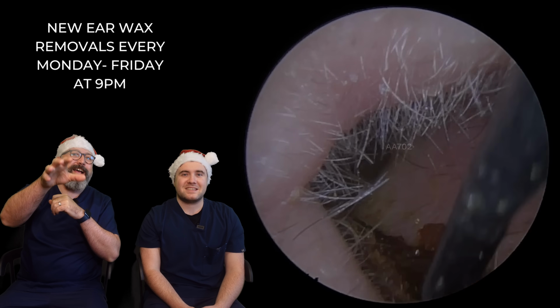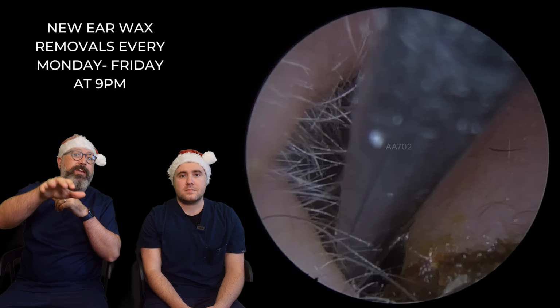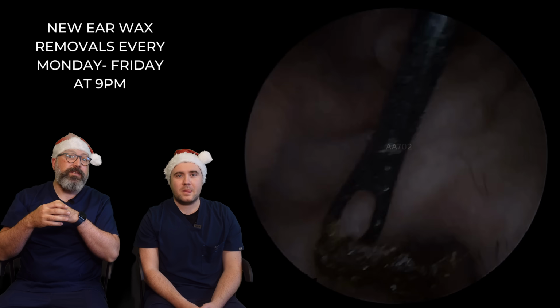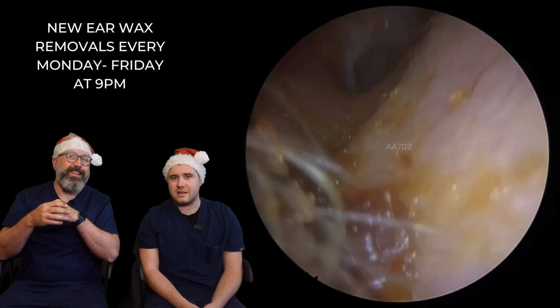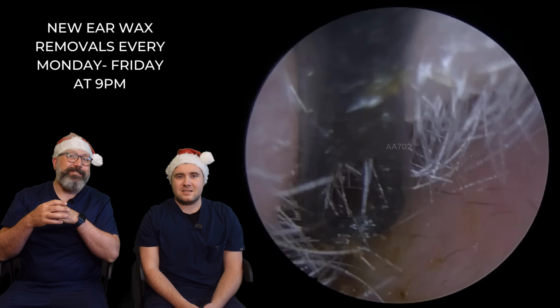This was obviously the bit that was anchoring it in place, because as much as I was trying to pull this forwards, it would not come away. In this bottom section, you can see it's really stuck down in there. So let's get rid of that piece. Any more? Yeah, I think there's a little bit just at the base of the canal there, so we've got to get rid of that bit as well. So we're just going to scooch over.